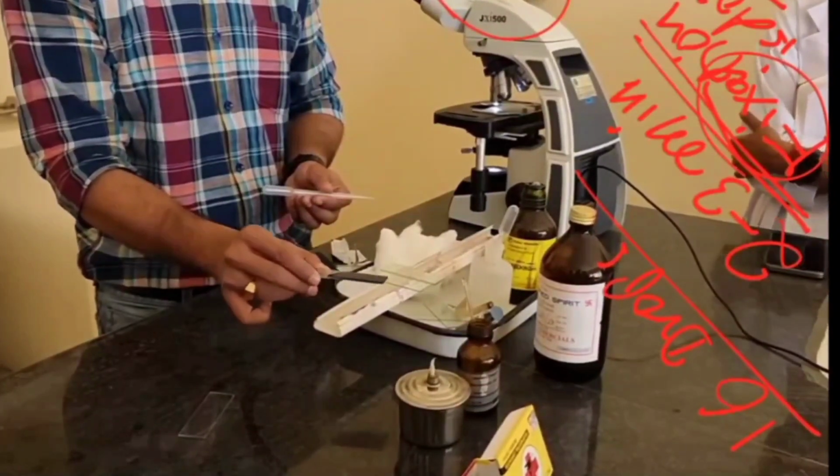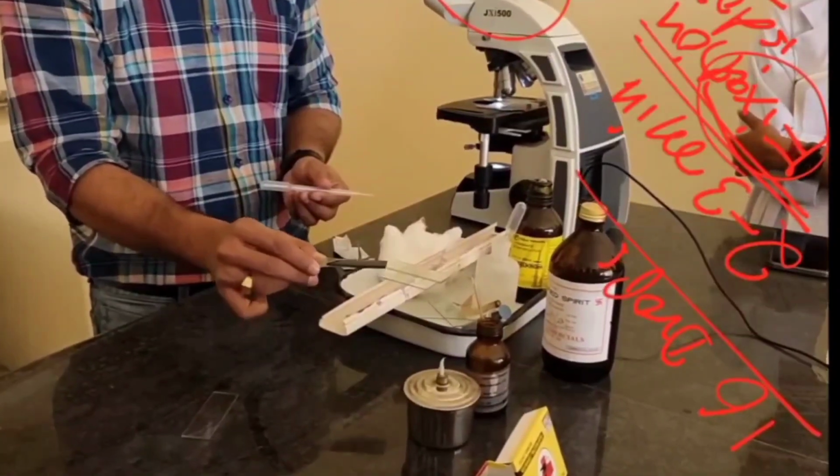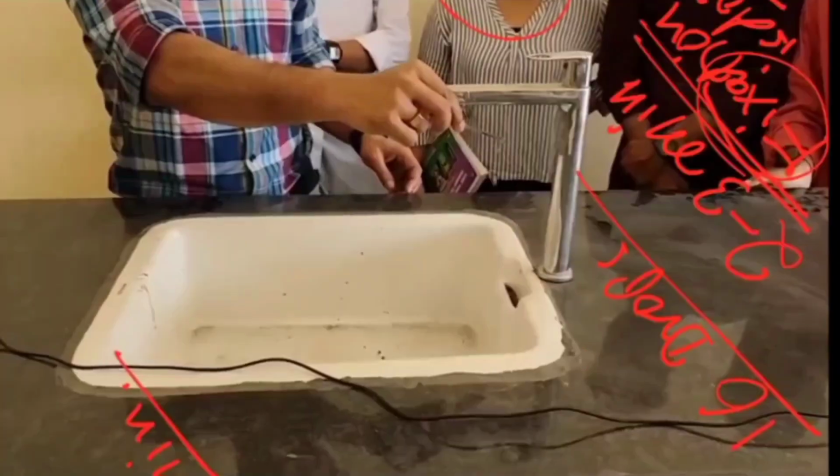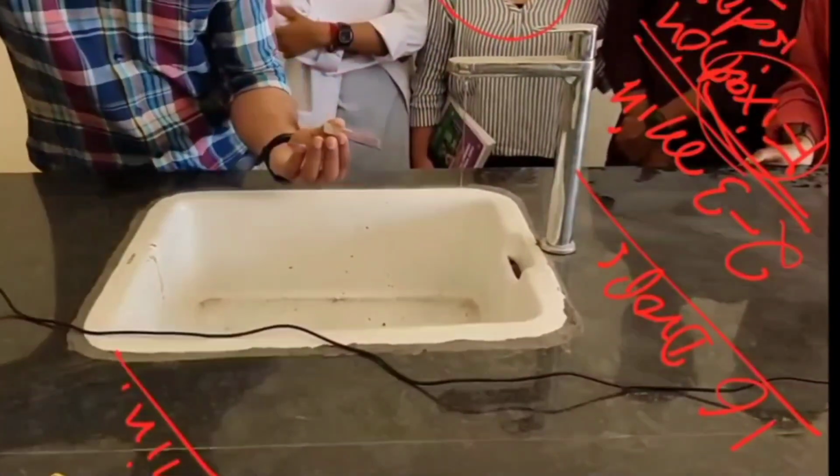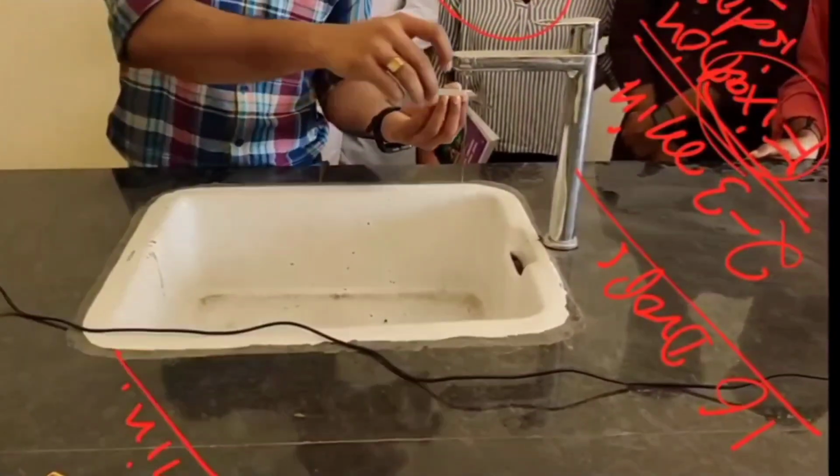So this is the way we can mix it. Either you can use a blower or any other thing to mix it. And after that, 7 to 10 minutes are over. Now I'm going to wash it. You have already seen, so 7 to 10 minutes are over.